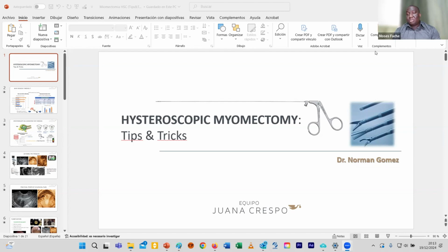When you're using a resectoscope, slicing gradually, you would soon realize that the volume of a 2-centimeter fibroid is about 4 cubic centimeters, whereas that of a 4-centimeter fibroid is about 33 cubic centimeters. So there's a difference of about 29 cubic centimeters. If you have that erroneous impression when you set out to resect this fibroid, you're going to run into trouble.